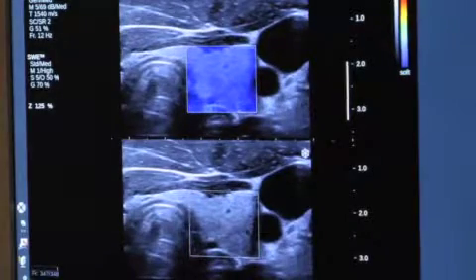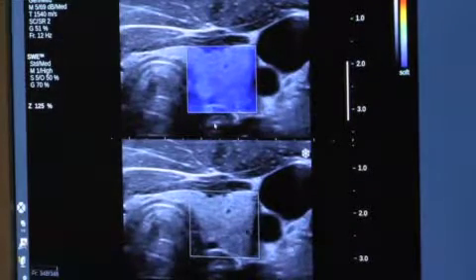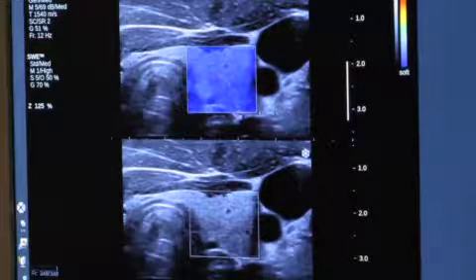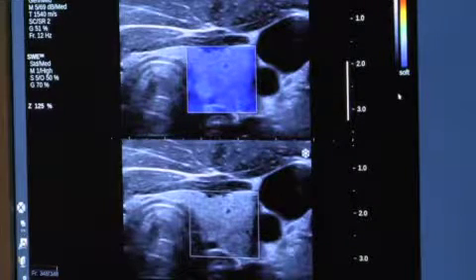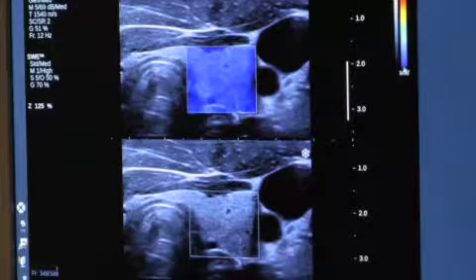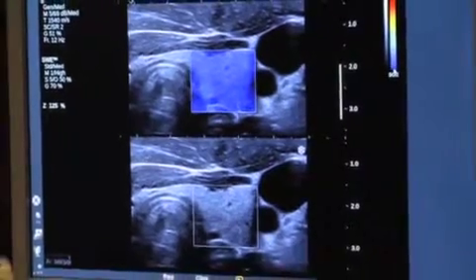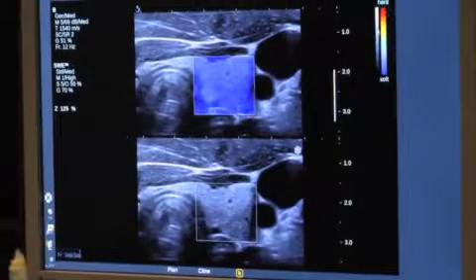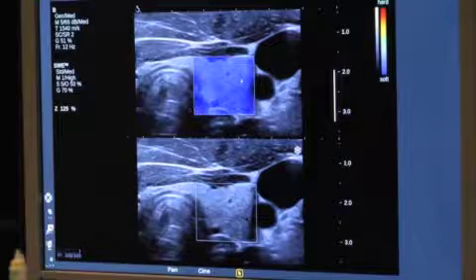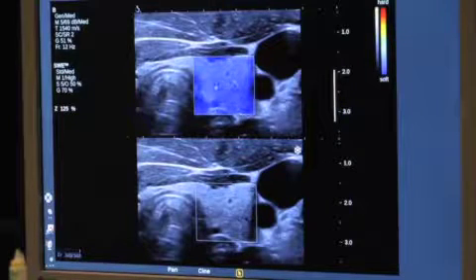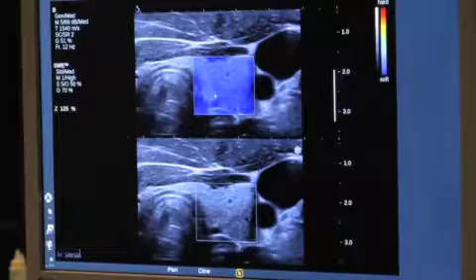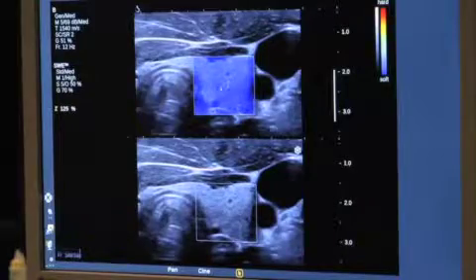I am going to freeze the image. Looking at the scale on the right side of the monitor, soft is coded as blue, and the higher you go on the scale, the stiffer the tissue becomes. Looking at my shear wave window, I can see that this thyroid tissue is blue and uniform, indicating normal thyroid tissue.